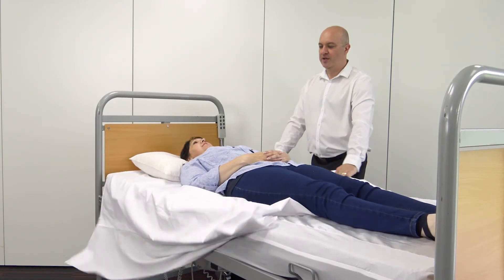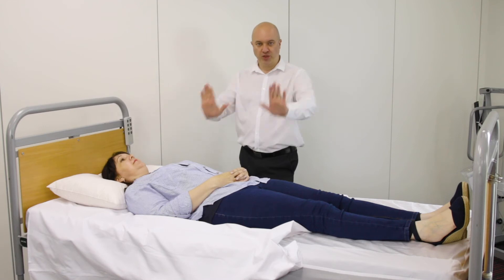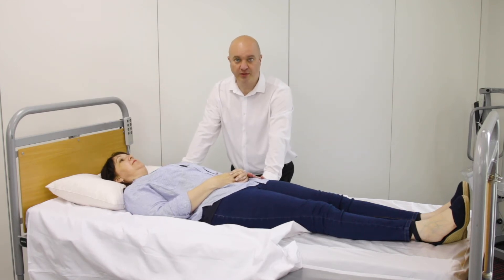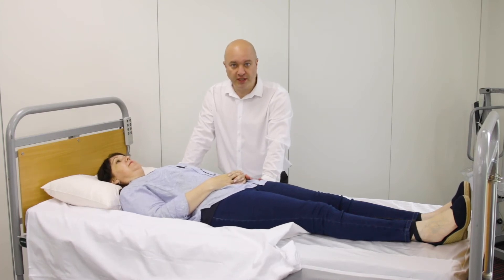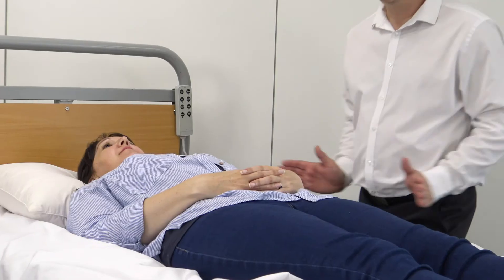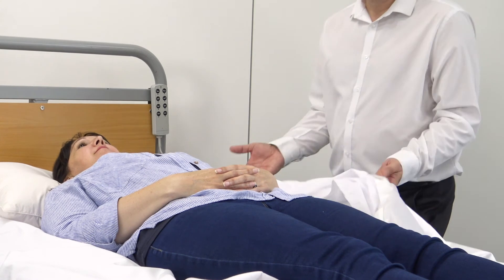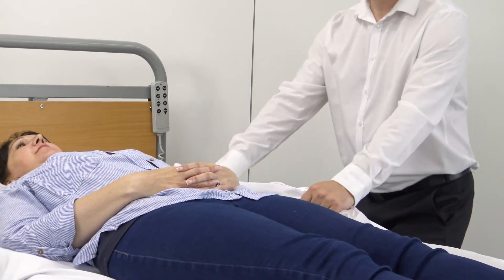One helpful little tip for you when you're pushing: don't push a person like you push a car. We tend to see people pushing downwards, which creates more friction and puts more pressure on the person. If you turn your hands sideways, you push straight across the bed. So when I'm pushing Sarah, my hands are sideways and all the force is going straight forwards. It makes moving a person a lot easier.